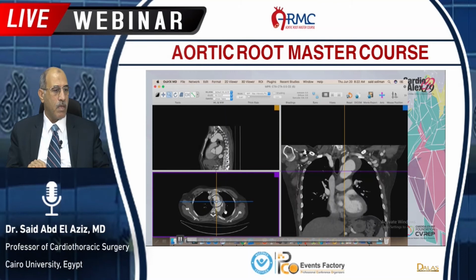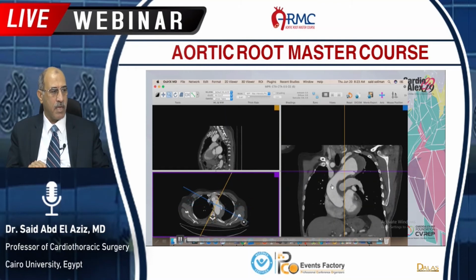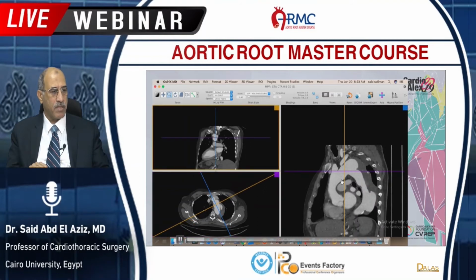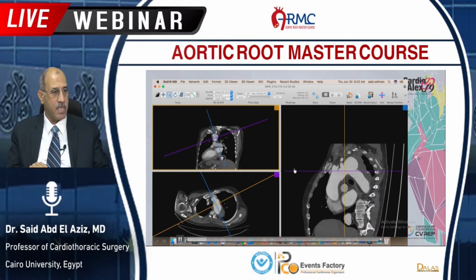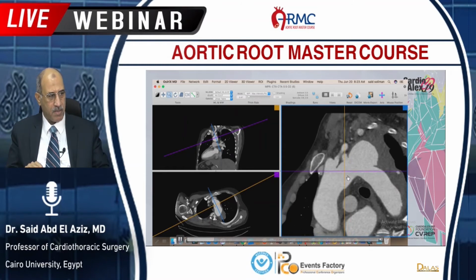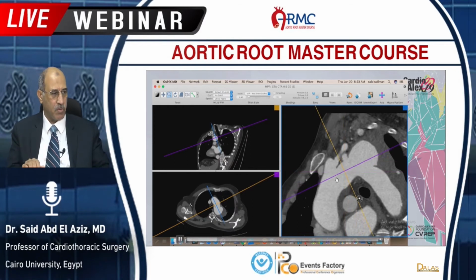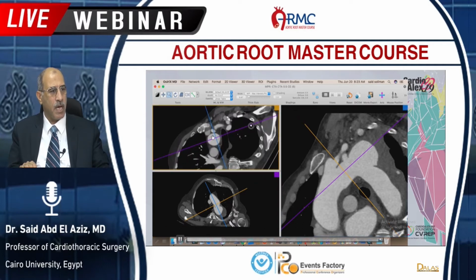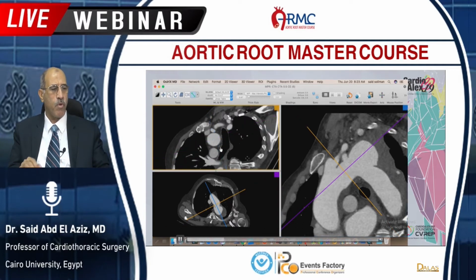Here, we increase the picture, and then we put the axis on the long axis of the arch, as we see here. And this is a good landing zone. We will now measure this landing zone. This is the proximal landing zone. We put the axis along the arch, so we got here a round circle, and we measure this round circle here. And that picture measures about 4 centimeter or 40 millimeter.